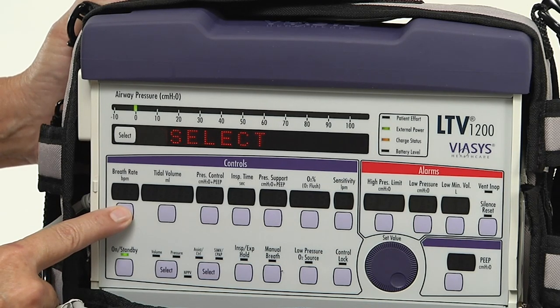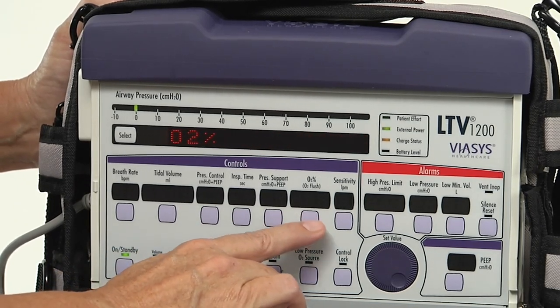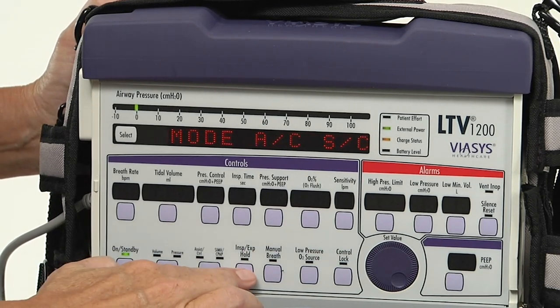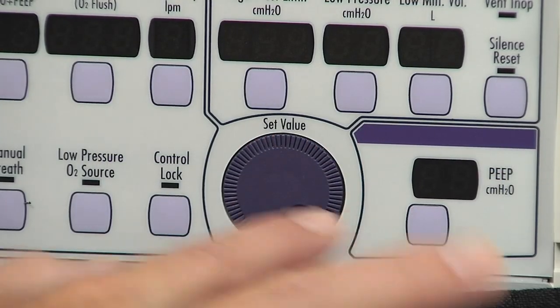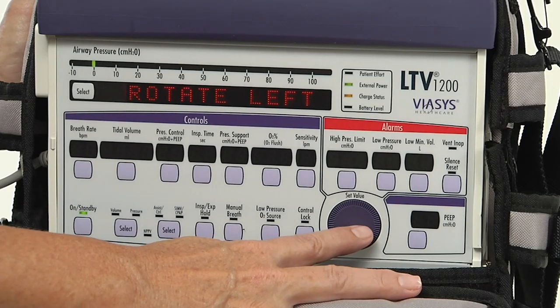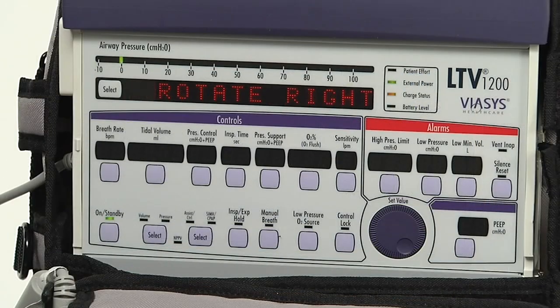When pressed, verify that the name of the button pressed is visible in the display window. Test the set value knob by turning it clockwise and counterclockwise — clockwise increases a value and counterclockwise decreases it. Verify that the settings visible in the display window reflect your rotations with the set value knob.